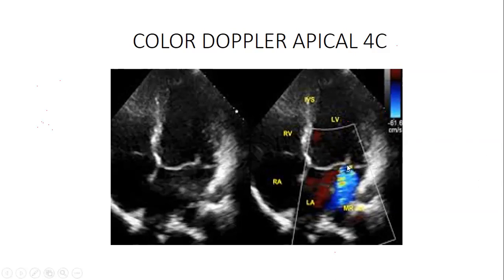When the mitral valve is closed, because it's closed, we can see here, it's closed, then the left ventricle is in systole, it's contracting. So when it contracts, this mitral valve must be tight. But we are having this backflow of blood coming this side and it's appearing blue. It's not appearing white.